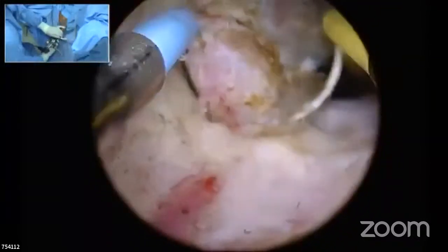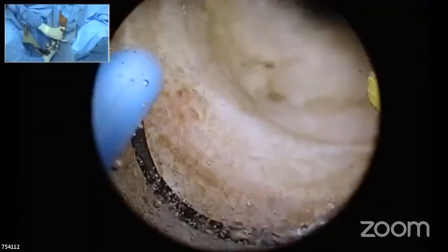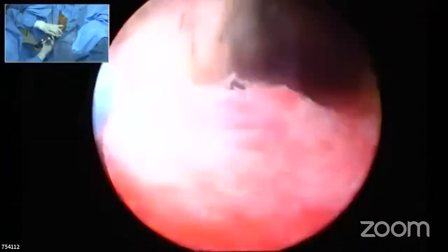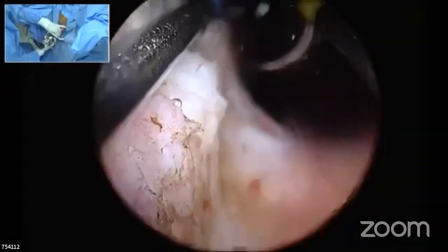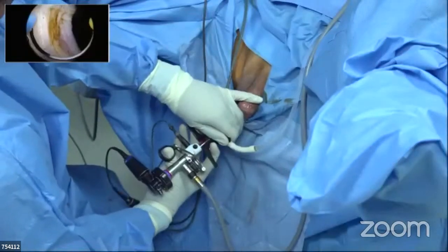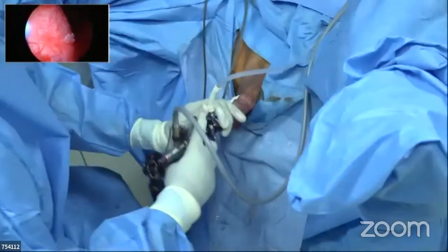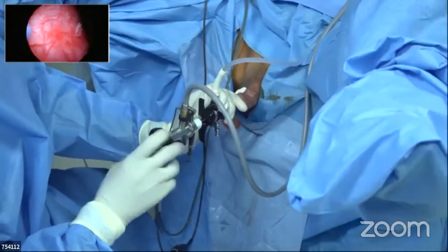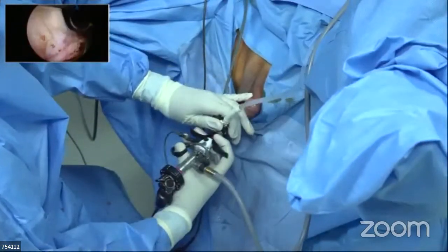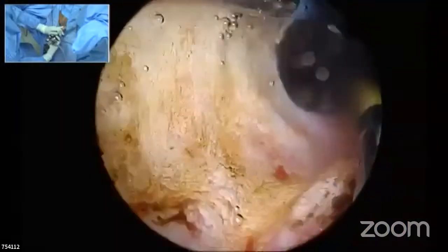If you are resecting at 11 o'clock position, why are we not seeing the loop at 11 o'clock? No, sir, this camera is not rotated. The camera is fixed to the scope, and I will not rotate it as it is. You want to have that sort of a vision? I'll show you. I'll unlock it. Once I unlock, this is what it is going to look like.